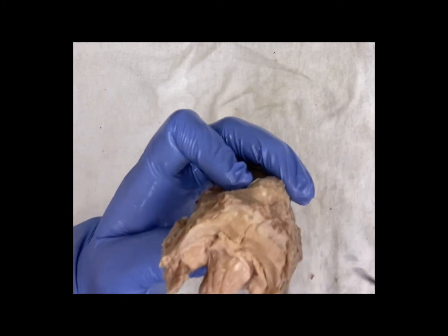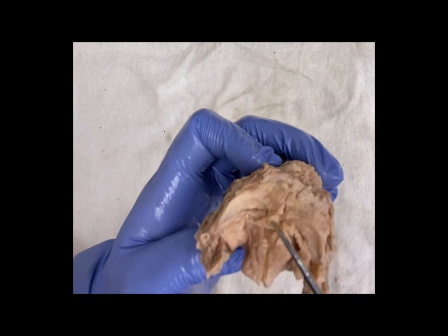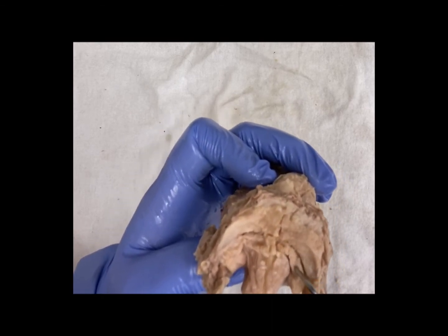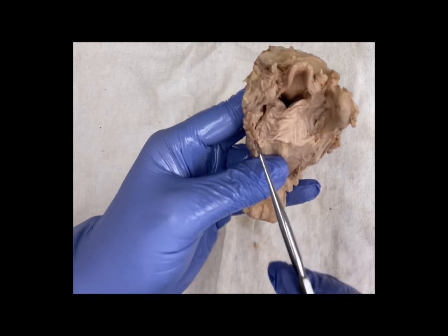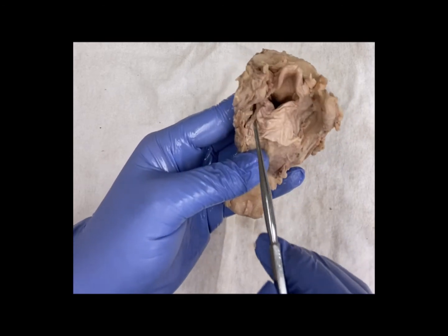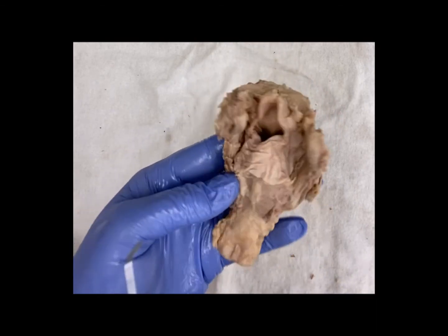So here, you can see that this is a great example of what an anterior mucosal margin might look like surgically. So here you can see that this has been cut. You can see the edge of the mucosa. So all of this would be that anterior mucosal margin, or that vallecular margin. So you have the anterior mucosal margin, you'd have another mucosal margin over here. Now, obviously, sometimes it'll be cut higher up, like over here. It just kind of depends on the specimen. But if you see the edge of the mucosa where it's clearly cut, this would be that margin here.